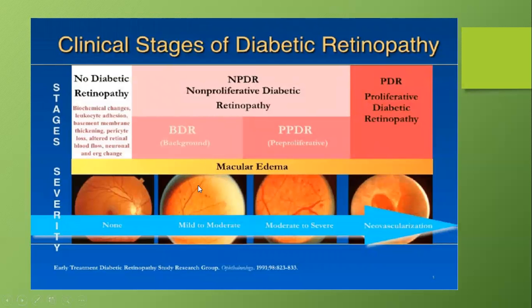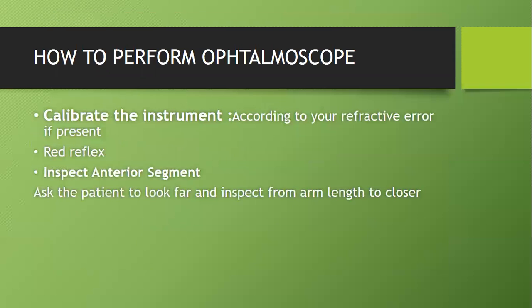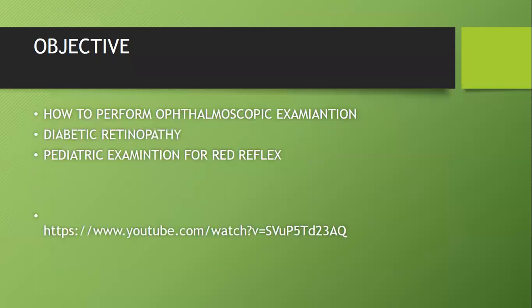So that's the whole scope of performing an ophthalmoscopic examination. Now, we are going to watch a video to see how we do the ophthalmoscopic examination.